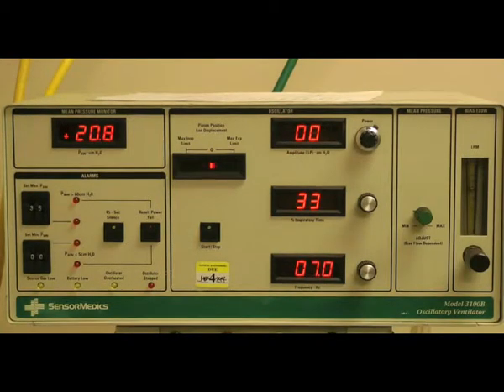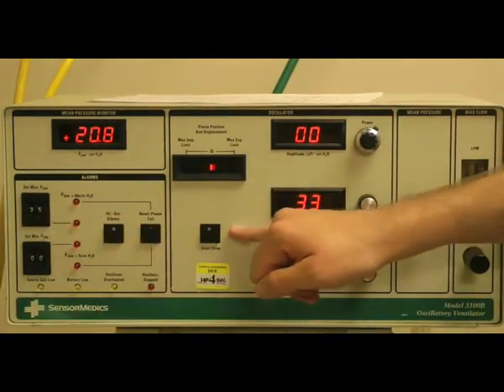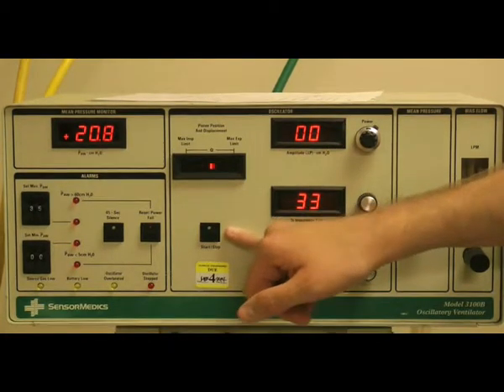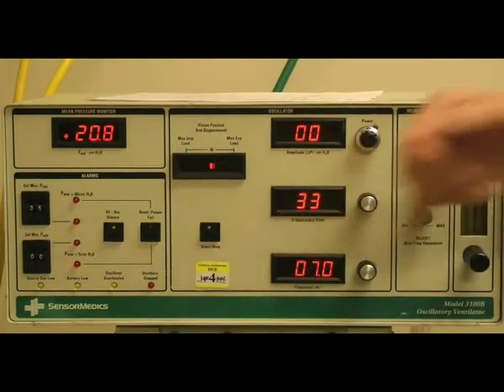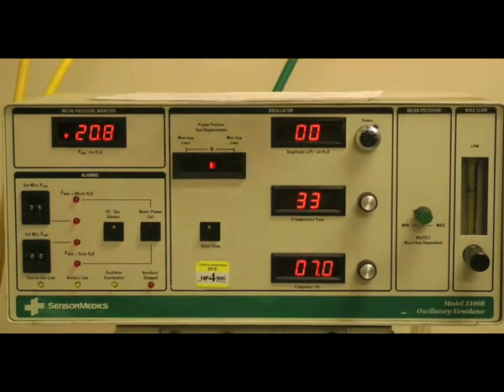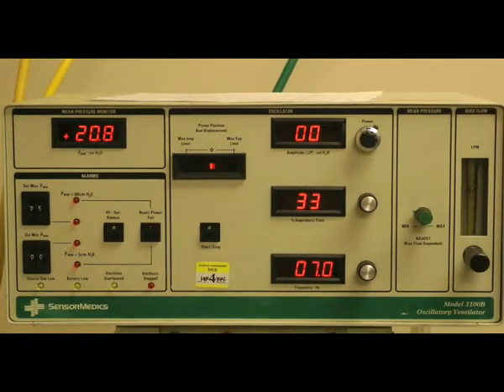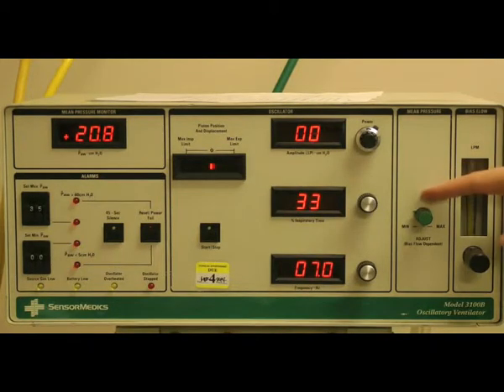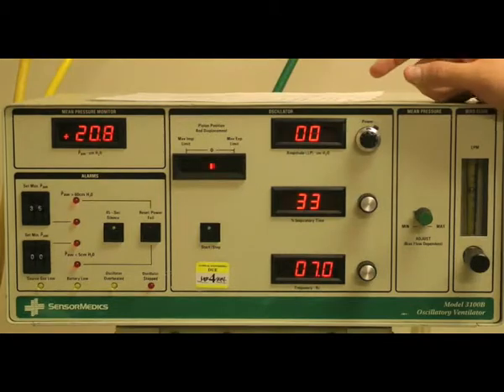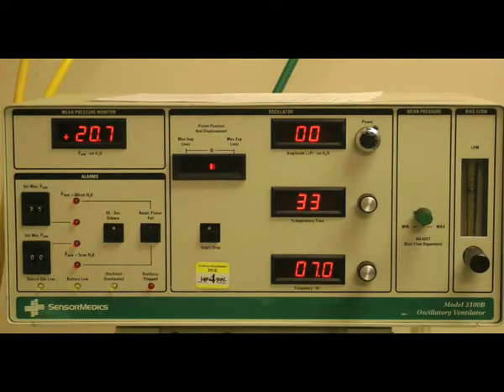To begin a recruitment maneuver, you need to set your high mean airway pressure alarm to 55 centimeters of water pressure. You'll also want to turn off the piston, which is done by depressing the start-stop button on the oscillator. You will then raise your mean airway pressure to 45 centimeters of water pressure via the knob on the right next to the bias flow. You'll want to achieve this mean airway pressure of 45 over a 10-second period. You'll then maintain 45 centimeters of water pressure for 45 seconds.